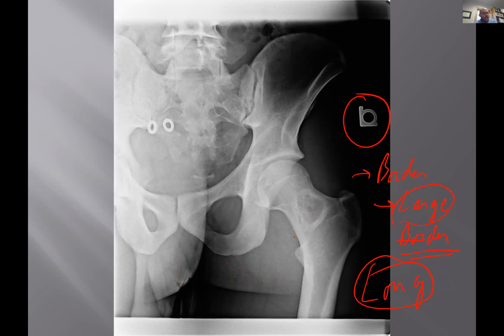Radiology is important, and it's a lost art. We are the last that are really doing this kind of thing. Even the bone and joint MD radiologists, do you think they're playing around with plain films and digital X-rays very much? Not as much as they should. They're going right to the CT, right to the MR. They're going right after it, and we have this, and we need to continue to be good at it.